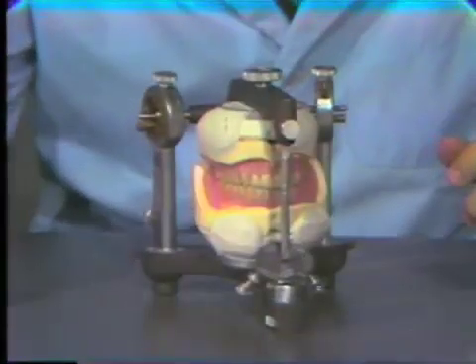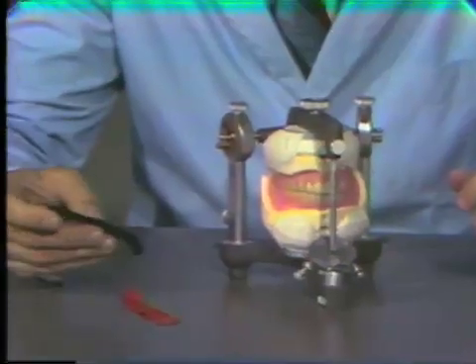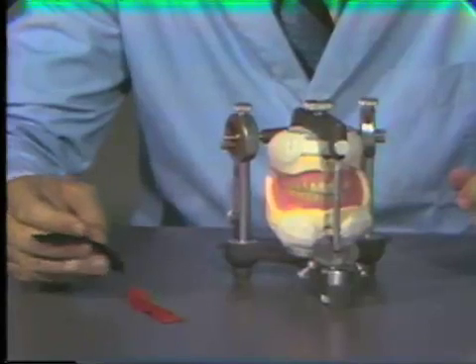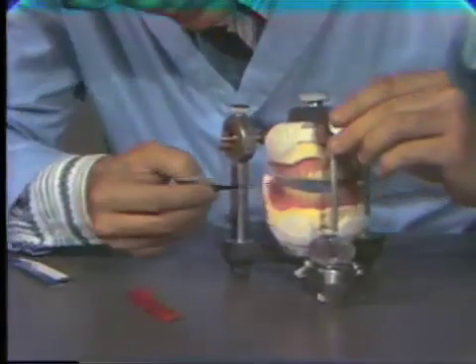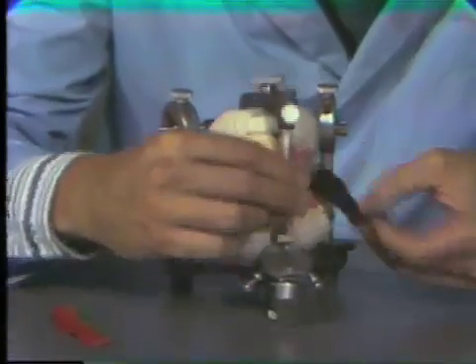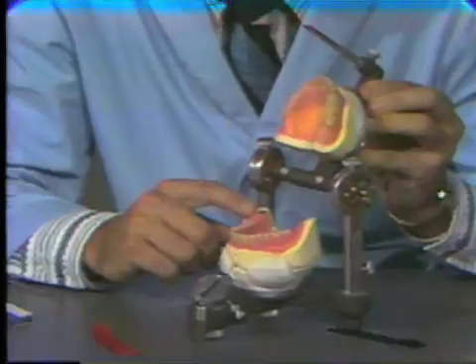This can best be marked either with the use of the red ribbon or the blue articulating paper. For television, the blue paper will mark a little bit easier so that you can see it. However, for discriminating marking, the red ribbon will probably be easier for you. Let's see if we can mark these prematurities. You can see that the heel is marking quite heavily in the blue ribbon, and also the lower buccal cusps.